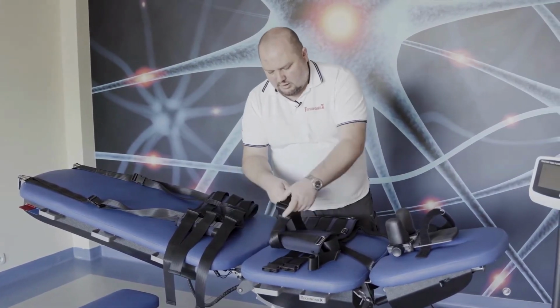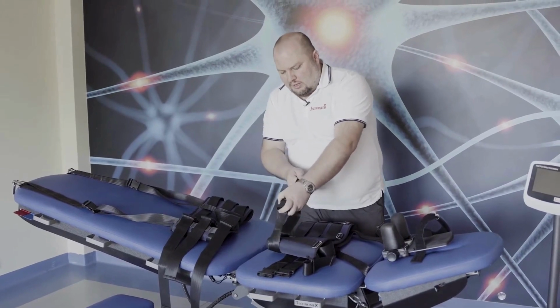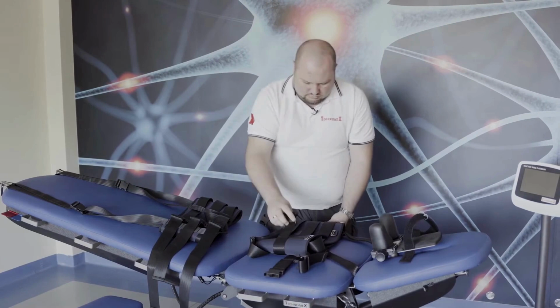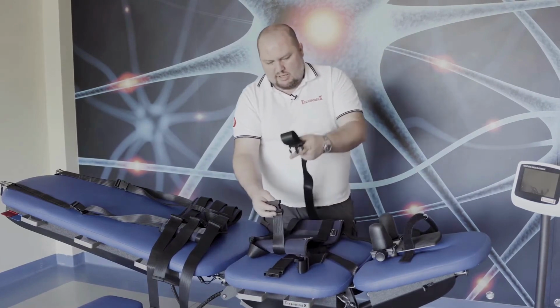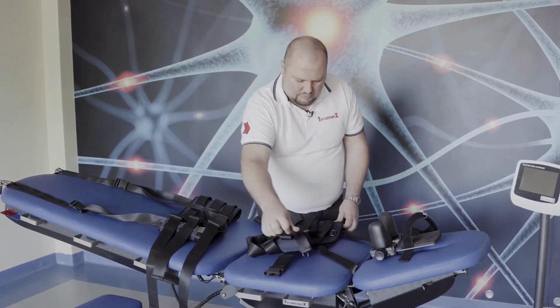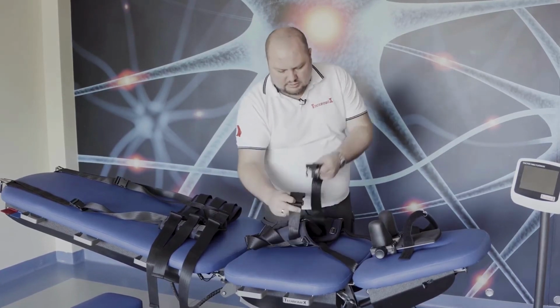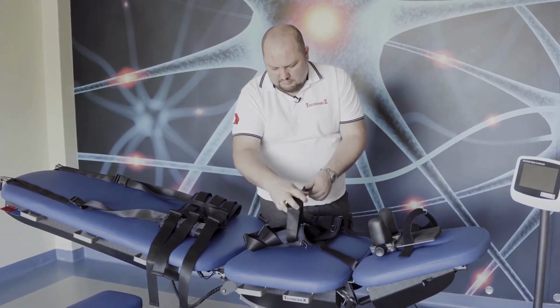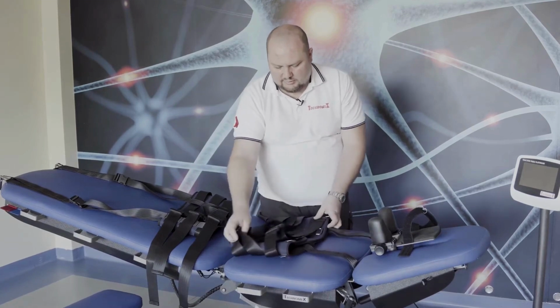We must tense the lower 2 strips, but the third one may be left loose. It's better to close all three of them, but not necessarily to make it very tight.